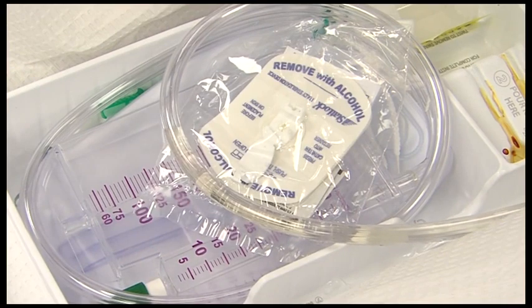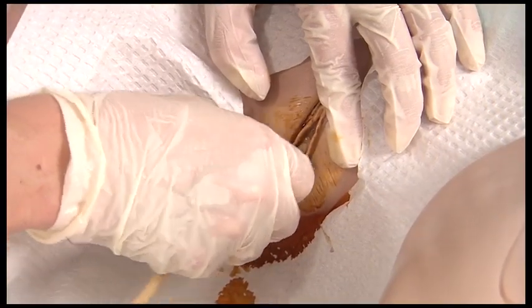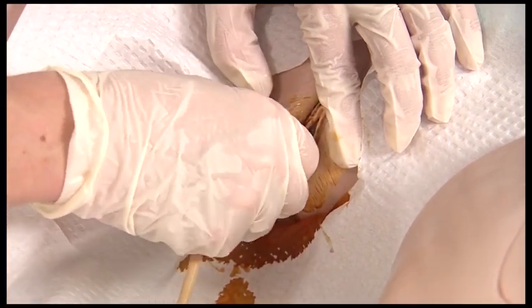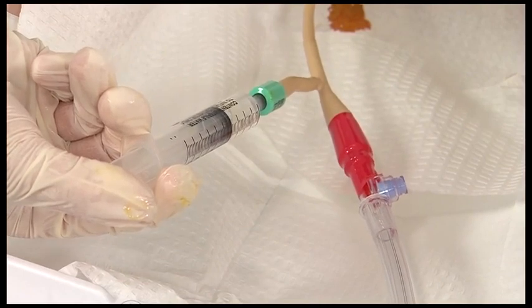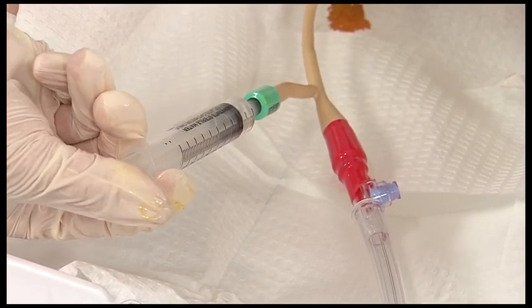After urine has begun to drain, advance the catheter 2 more inches, or around 5 centimeters, and inflate the catheter balloon with the entire 10 milliliters of sterile water provided in the syringe. Only sterile water should be used to inflate the balloon. Remove syringe. When inflating the balloon, observe the patient. If the patient complains about pressure, stop immediately.